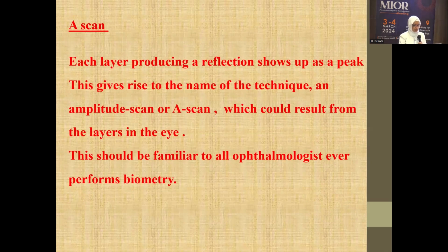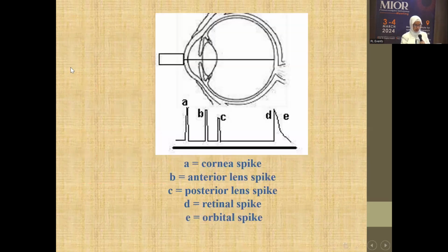eye. This should be familiar to all ophthalmologists who have ever performed biometry. All of us are doing biometry and know about A scan. This is different A scans, and it represents.